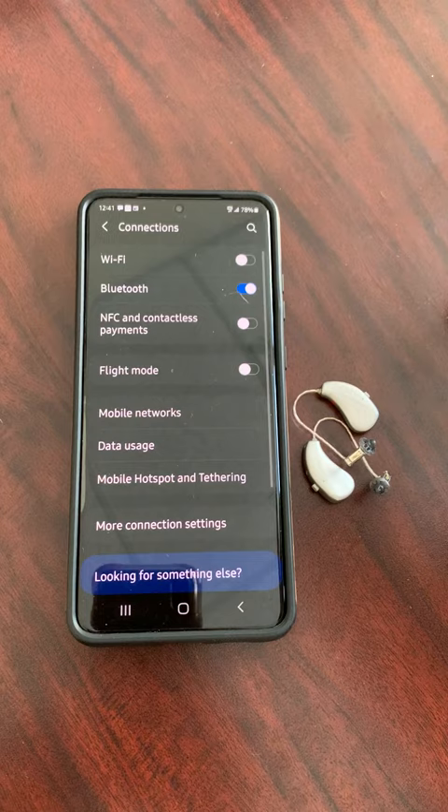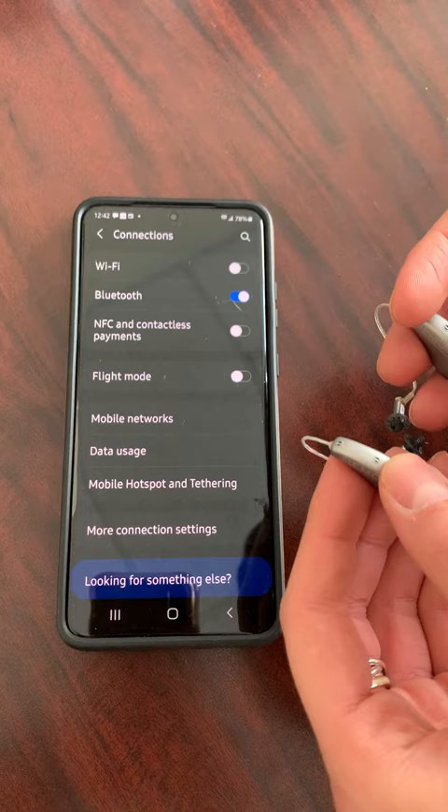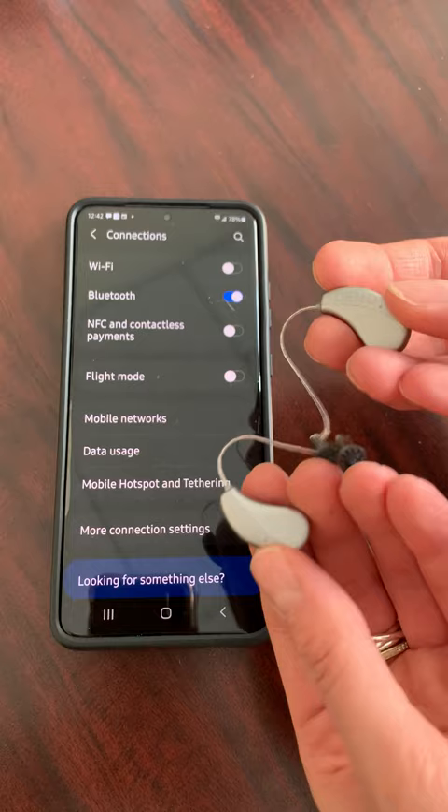Go into the settings of your phone, then go to Connections, and then you want to put your hearing aids in pairing mode. You're either going to open and close the battery doors if you have traditional batteries, or turn the hearing aids off and then back on again if you have rechargeable hearing aids like these ones here.